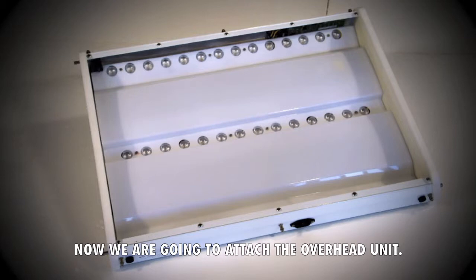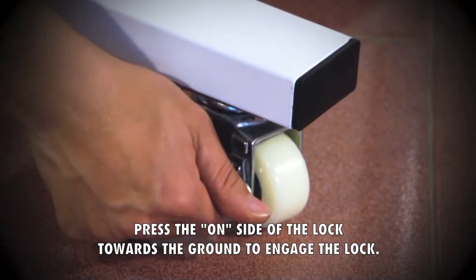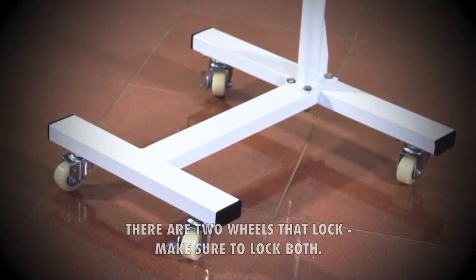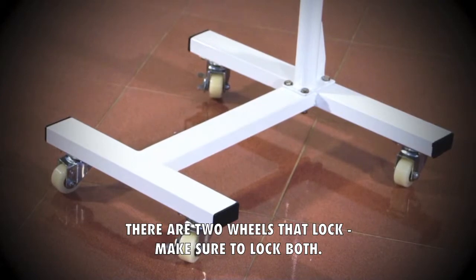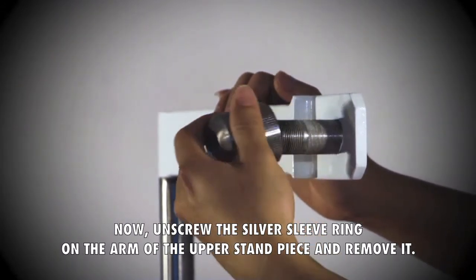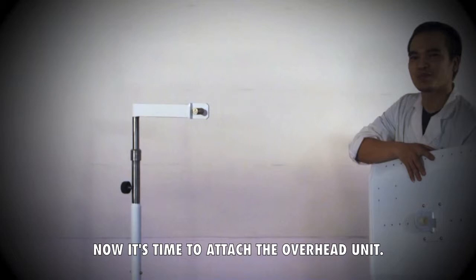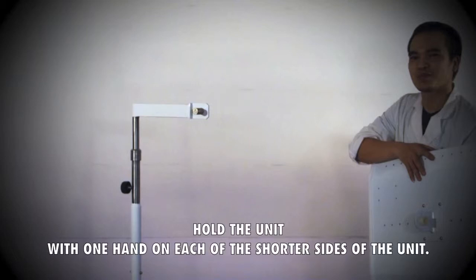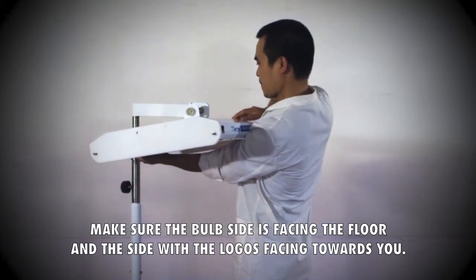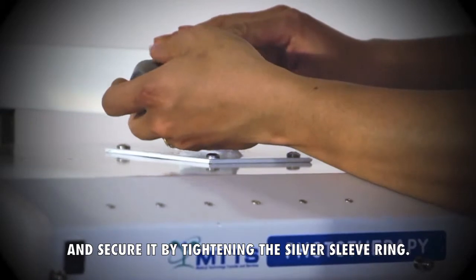Now we're going to attach the overhead unit. Before you start, make sure to lock the wheels. Press the on side of the lock towards the ground to engage the lock. There are two wheels that lock — make sure to lock both. Now unscrew the silver sleeve ring on the arm of the upper stand piece and remove it. Place it to the side. Hold the unit with one hand on each of the shorter sides. Make sure the bulb side is facing the floor and the side with the logos is facing towards you. Slide the unit onto the upper stand piece and secure it by tightening the silver sleeve ring.